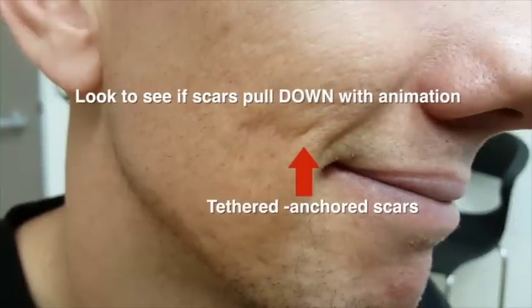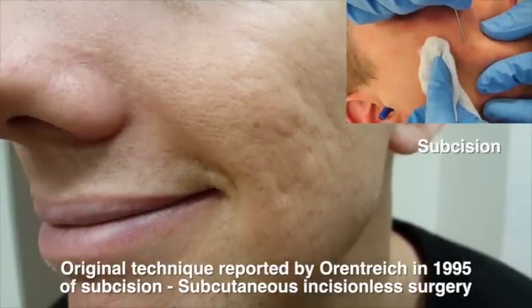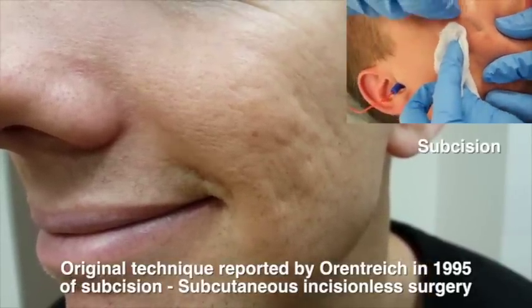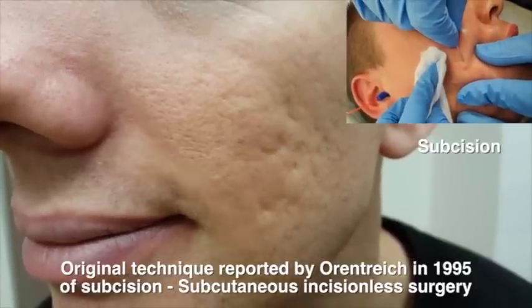There are many ways to perform subcision. However, the original paper by Oren Teich in 1995 shows this particular method. It's called the wiper method using a single entry point.